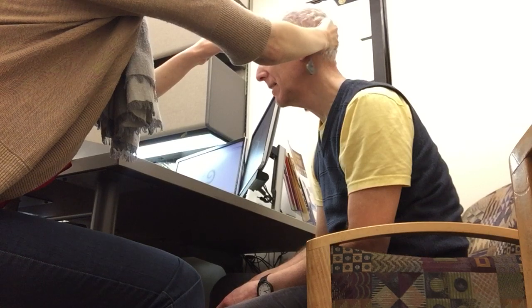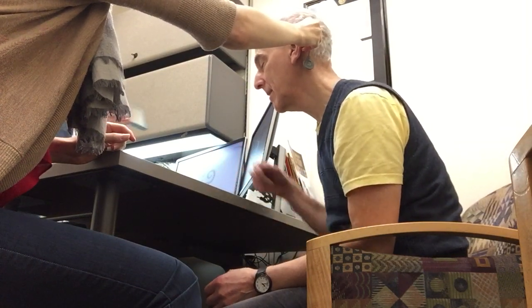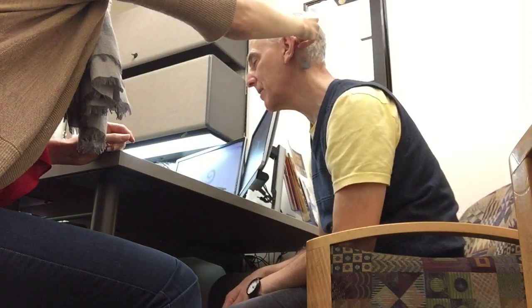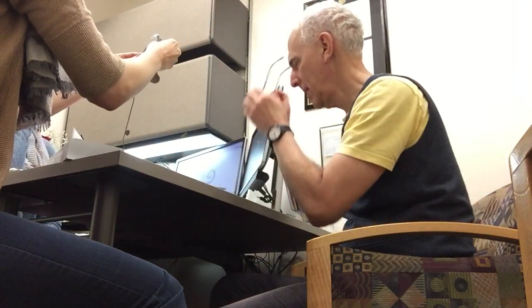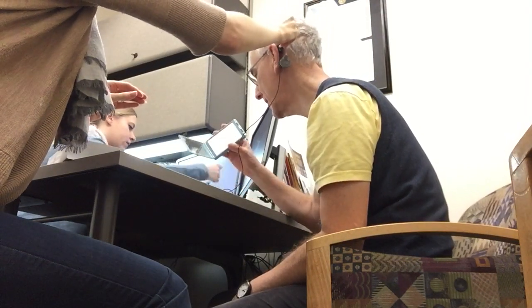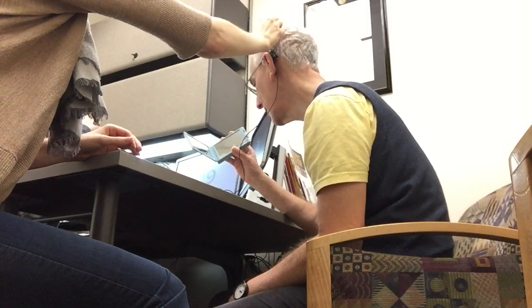Yep, right like that. It's not going to be ideal because right now I don't have a battery attached, but how does it look? Is that a mirror? Yeah, I wanted to see how it's on there. You see it? Okay, good. How does it feel? Will it fall away if I let it go? It's going to fall. If I connect the cable, let's do that, and then that might help keep it on. Okay. And then your magnet. That just balances. It doesn't snug like these do. Okay, there we go.